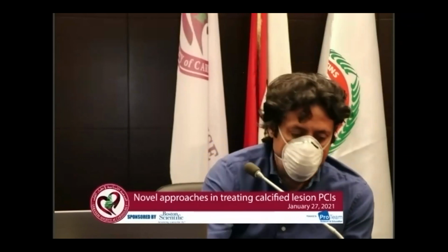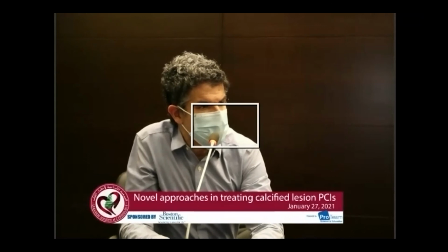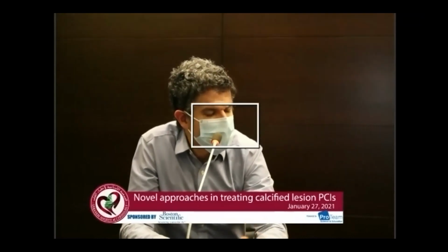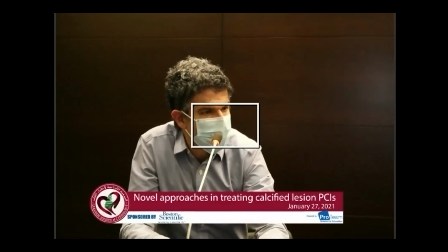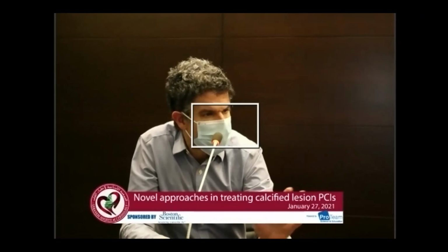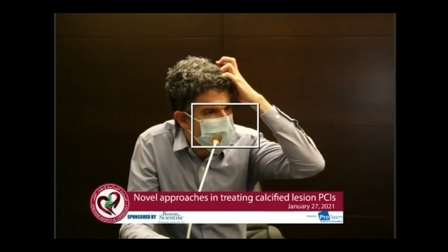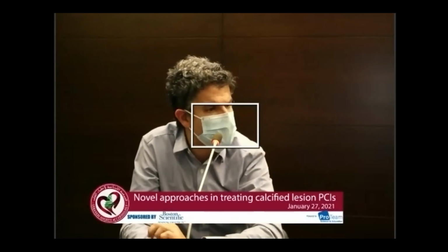Just a small question. Obviously, you're a huge volume center, but how often do you resort to using guide extension to avoid proximal tortuosity involvement by the rota, and when you have a mid to distal lesion, in that case, do you upfront go to a 7 French guide with a 6 French extension for ease?